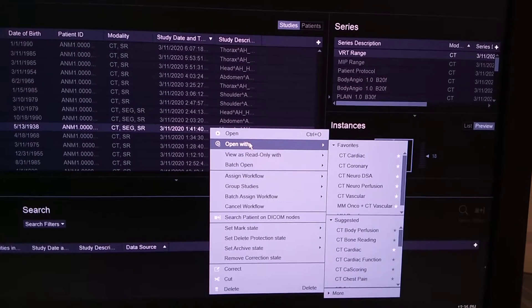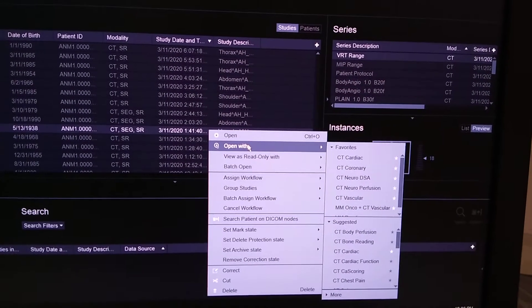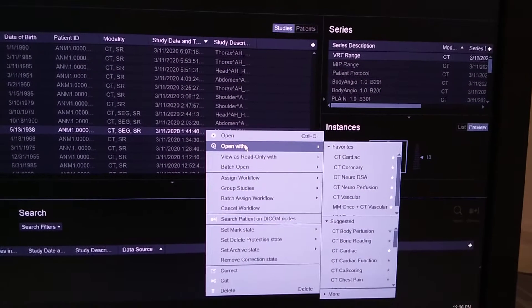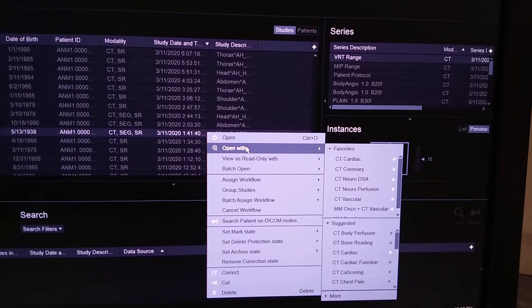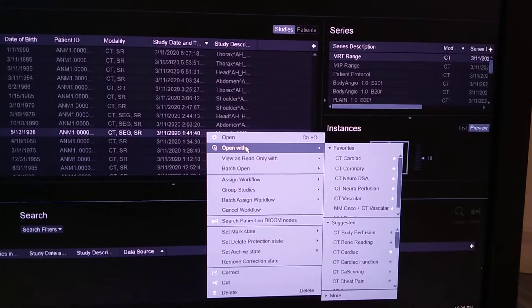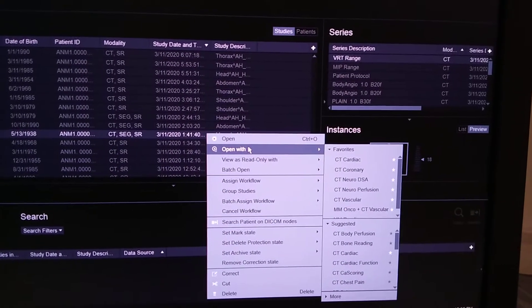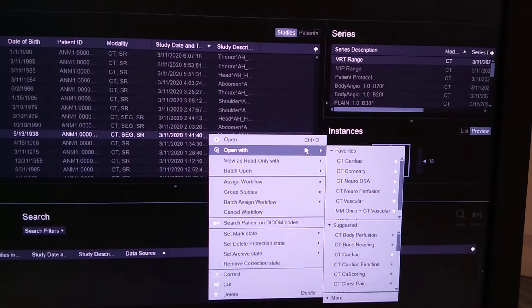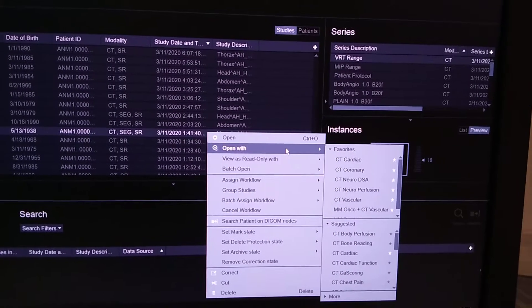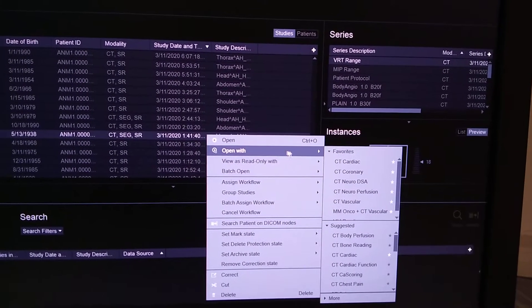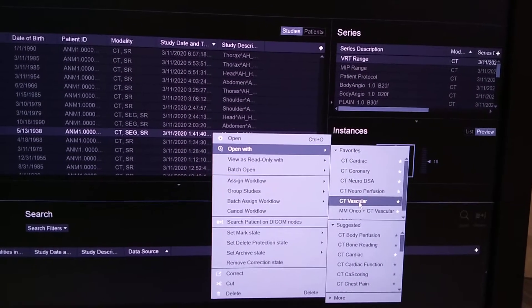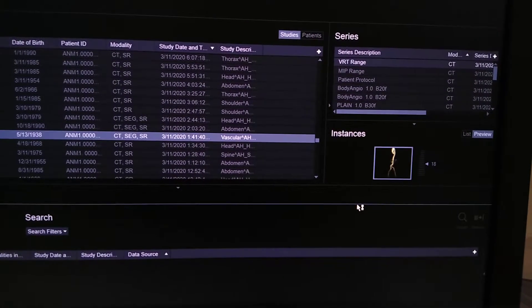Hello guys, today we will see the post processing of CT chest and abdomen angiography. We have to select the patient and open with CT vascular.